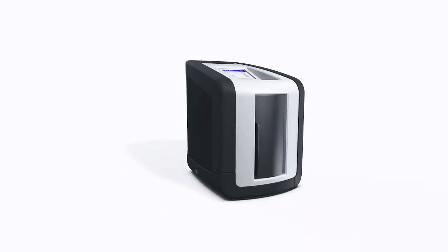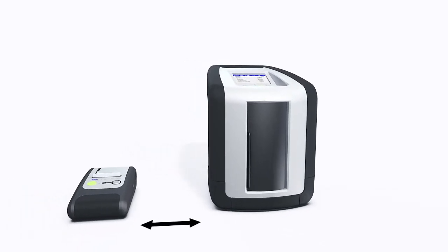You can print out test results from anywhere, anytime, using the optional printer available from Draeger. Place the printer to the left of the analyzer, about a hand's width away. Make sure that the two infrared interfaces are facing each other.